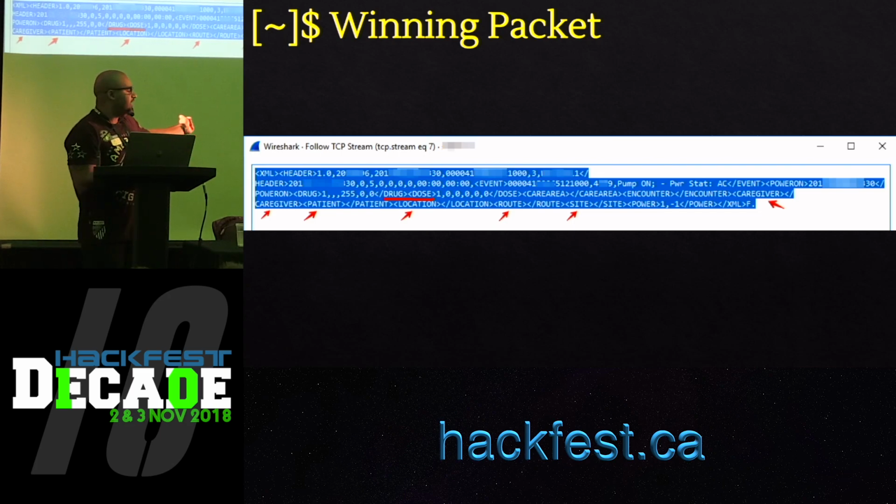You will see that all these fields here are empty, but that's just because our Infusion Pump didn't have real data. In a real environment where it's deployed at a hospital, it will contain all that information. And once you receive that information, you can update it, fix the XModem checksum, and push it back to the Infusion Pump. We were able to do that.